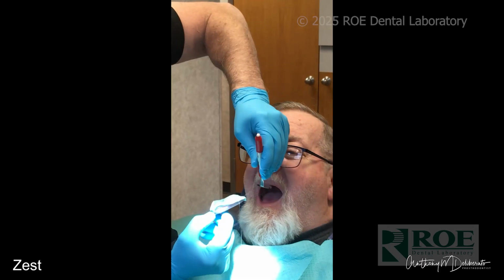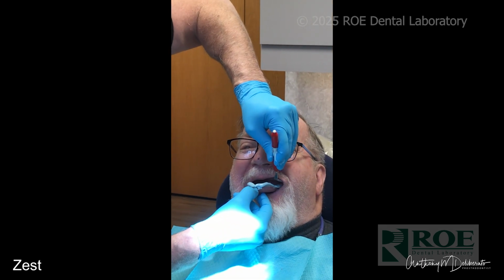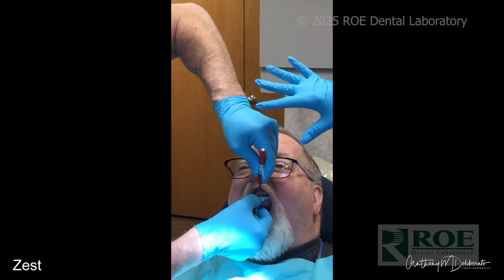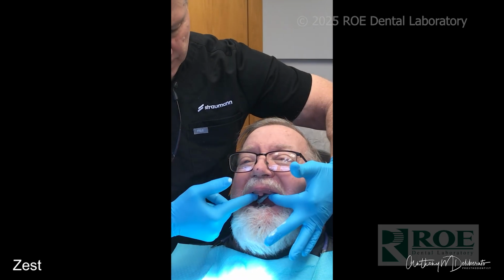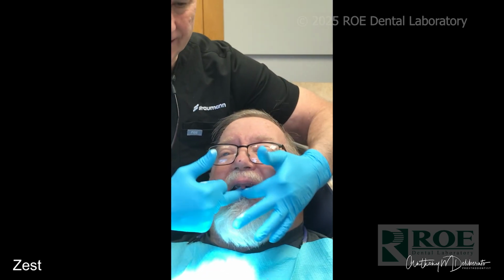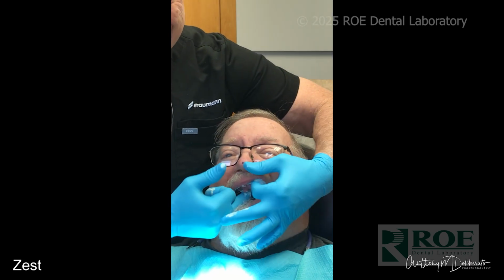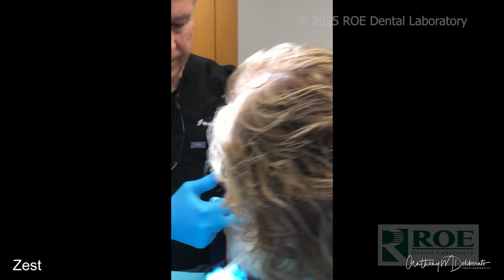Just a little video of taking that impression. And it becomes even more important when you have a removable or a non-implant supported arch against these implant cases, because the opposing arch becomes the one that's going to get dislodged from our nice, strong, implant-supported types of restoration.